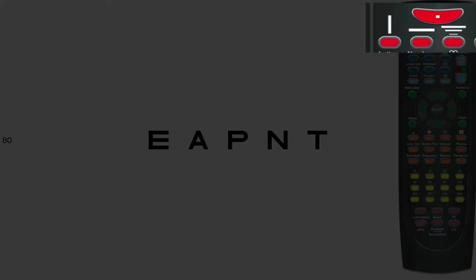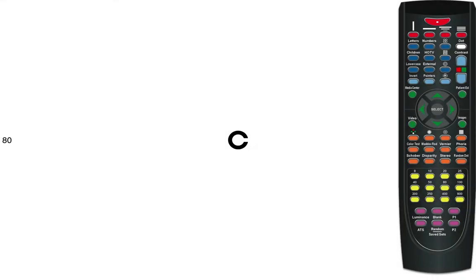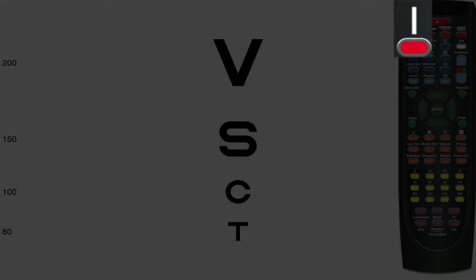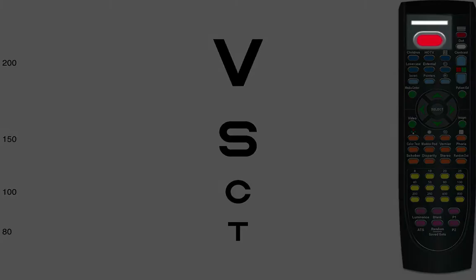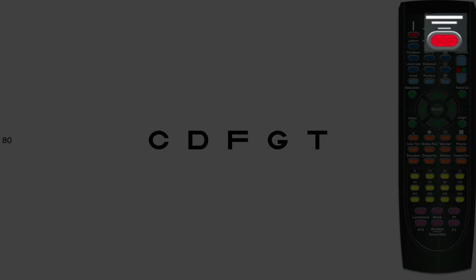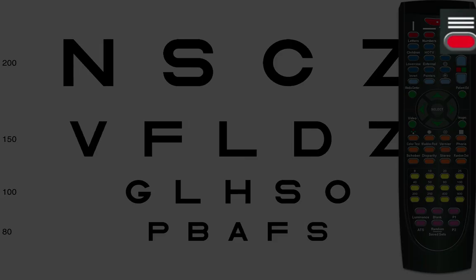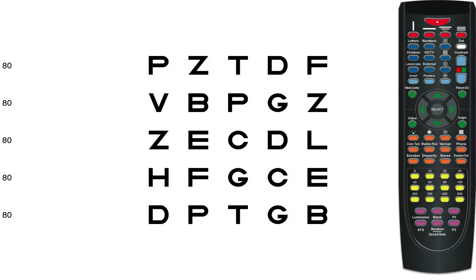Red buttons are the display buttons. The top button gives you one optotype. This button gives you a column. This one gives you a horizontal line. This one, a multi-line different size. And multi-line same size. Notice that the picture above the button tells us what the button does — easy as that. Press the button and change the display.